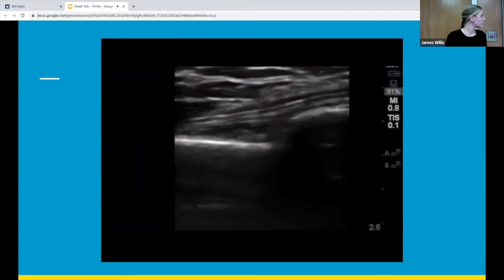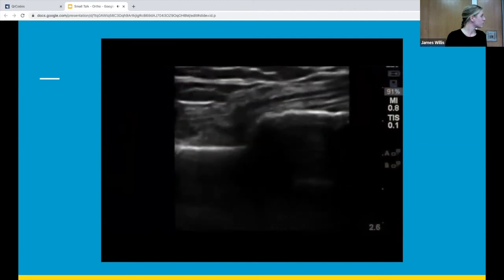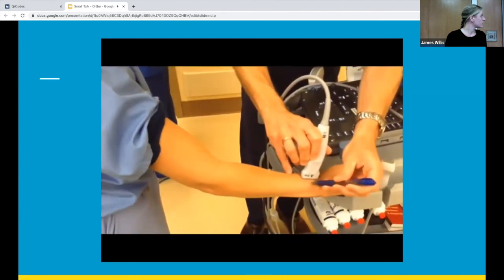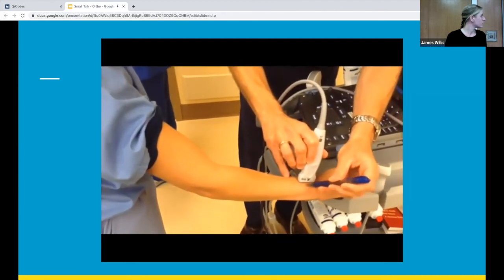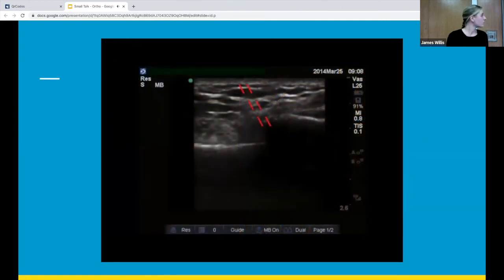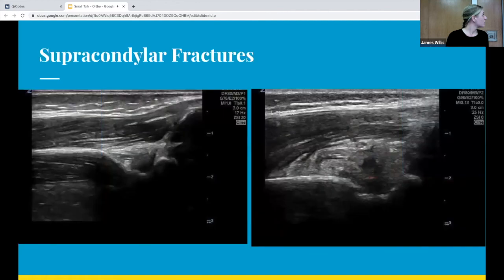After finding the fracture, align it in the center of your field. Then mark this with a pen on the patient's skin. Make the mark a couple centimeters away from where you will be sterilizing and injecting. Perform the hematoma block in standard fashion with your needle entering obliquely into the fracture site. Perform your reduction in the standard manner. Sorry, that goes more into the blocks. I just wanted you to see the technique for diagnosing the fracture.